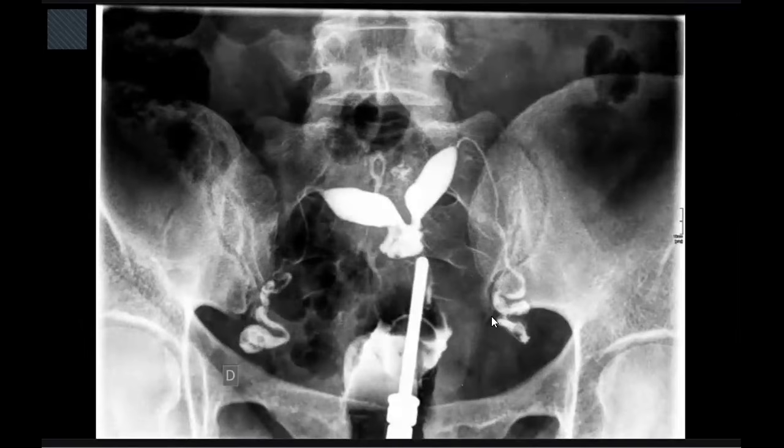Doctor, can you hear me well? Yes, yes. We are asking about the uterus itself. What's your differential? Okay, uterus.